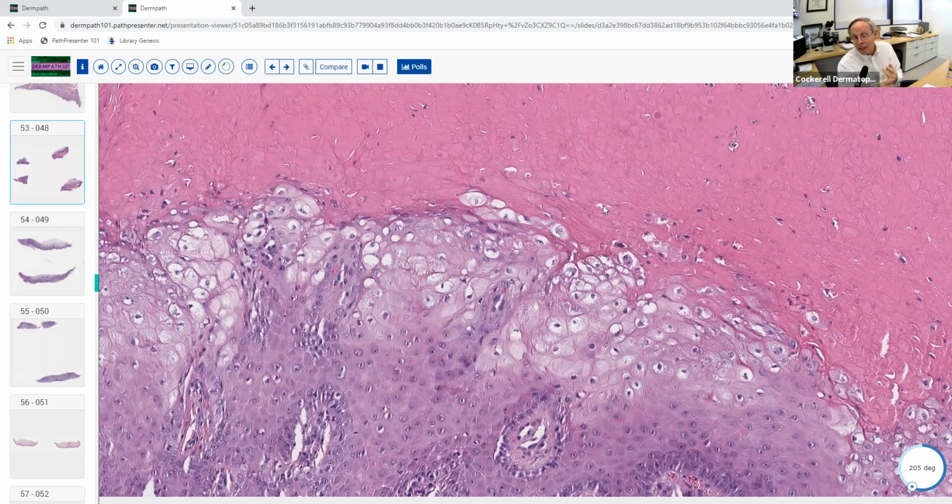But it's clearly not polyomavirus, which can be seen with Merkel cell carcinoma and the trichodysplasia spinulosa that we see with people that are in renal transplants. It's not herpes virus, obviously, because that's going to give you the multinucleated giant cells that are acantholytic, and this is a ballooning process on the hand. It's not a flavivirus. Those are things like West Nile virus and some of those things. That's an RNA virus. It would never give you a skin lesion like this ever.